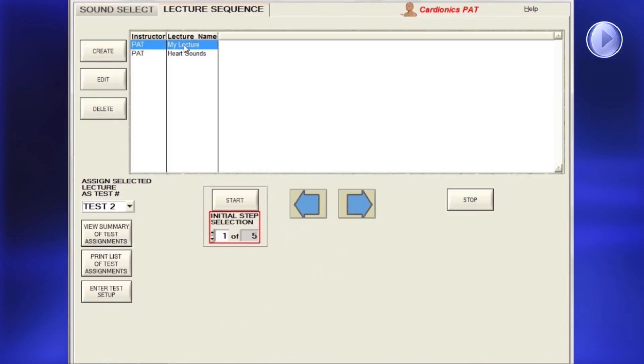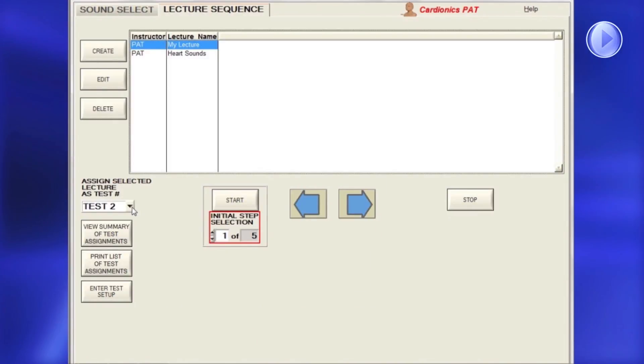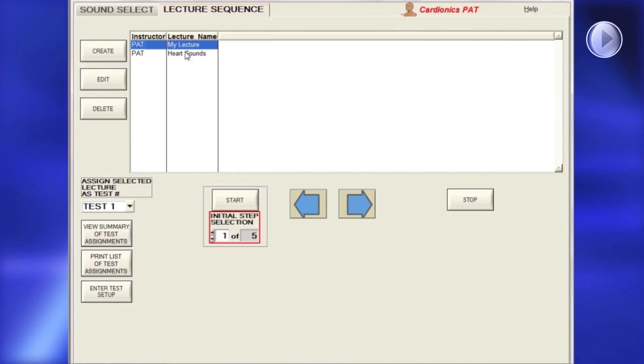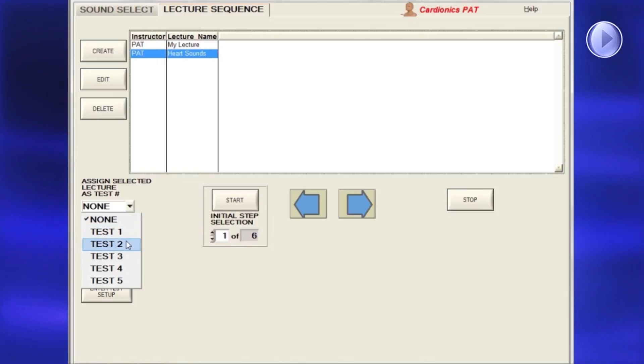If a lecture is to be used as a test, it must be assigned a test number. To create a test, select a lecture sequence, instructor, and test number, then click Start.